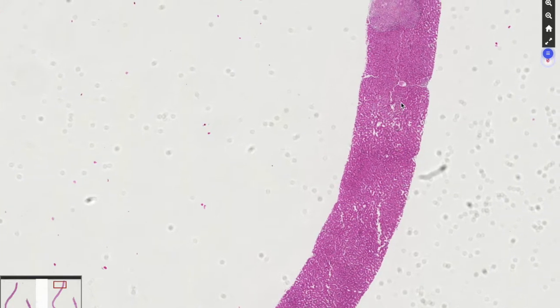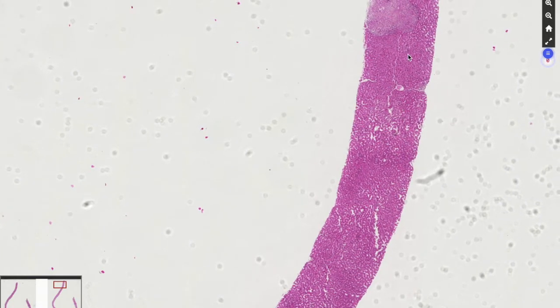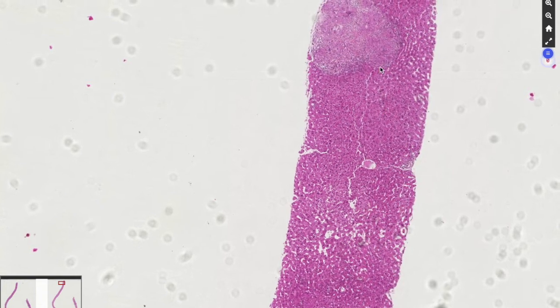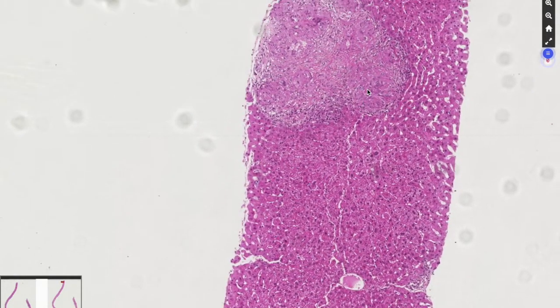And what I did not tell you regarding the clinical data, but it was on purpose, is that he also had mediastinal lymph nodes and micronodules in the lung. So now let's look at the biopsy. It's really a straightforward case.